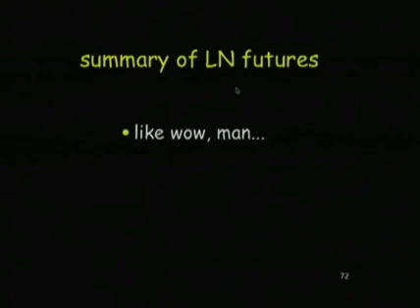So in summary, ultrasound of the axillary lymph nodes is way better than CT and even better than MR right now, although sub-millimeter isovolumetric MR may hold some promise in the future. You would still biopsy the lymph node under ultrasound guidance, so you're still going to have to be able to evaluate lymph nodes with ultrasound.